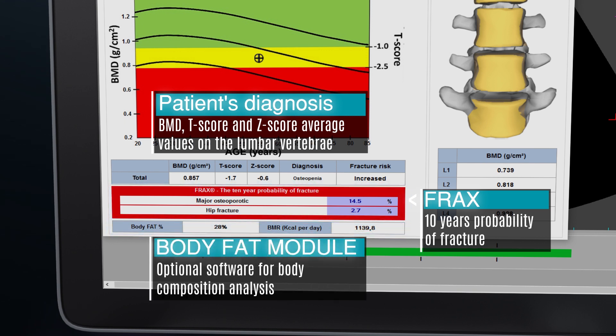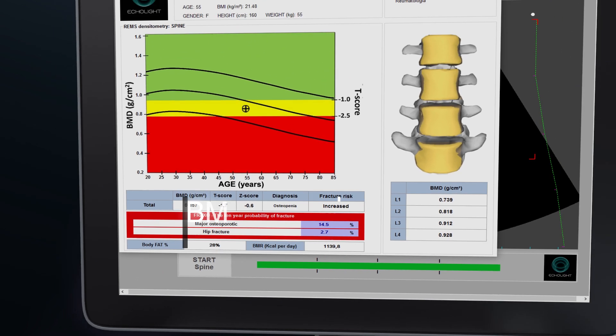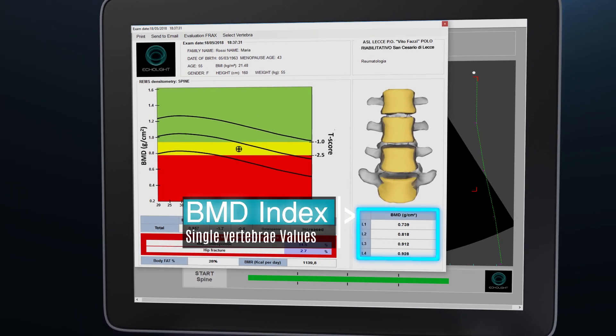The 10-year probability of fracture is displayed at the bottom of the medical report. With an additional software, the body composition information in terms of fat mass percentage and basal metabolic rate can be seen in the medical report. The BMD values of every single vertebra are displayed on a bottom right chart.